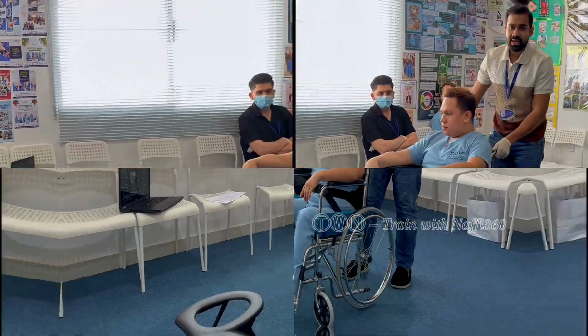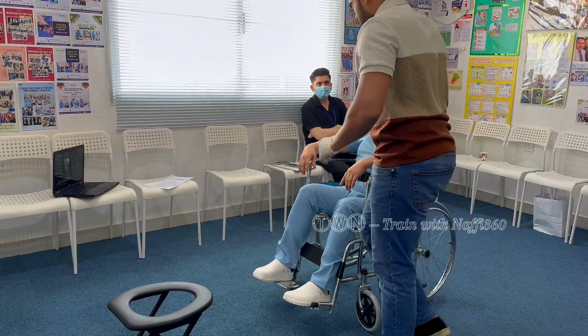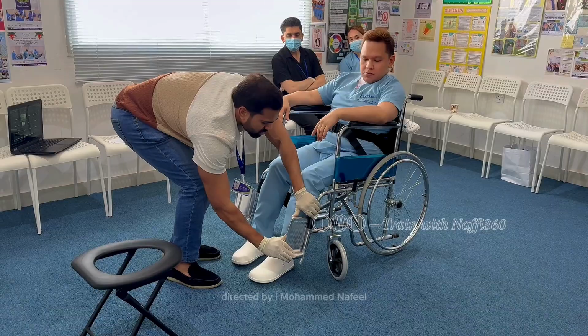Alright, as we move on in the video, ensure the wheelchair is stable and the brakes are locked. Place the patient's feet flat on the floor and close together for balance. Secure a gait belt around the patient's waist to provide support.